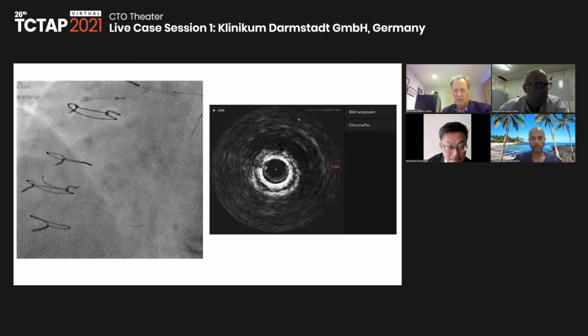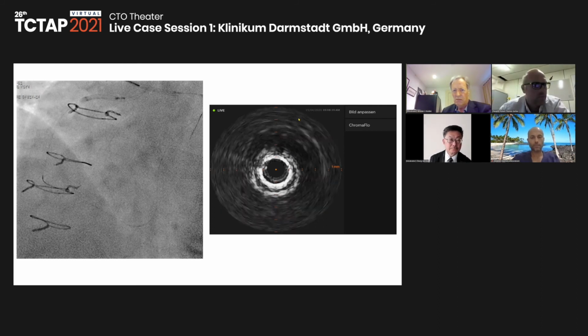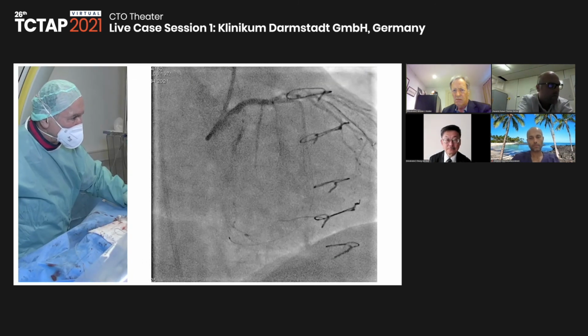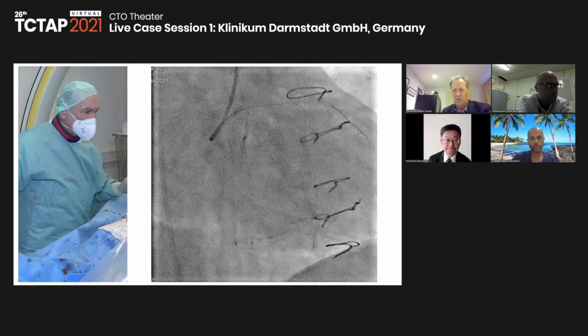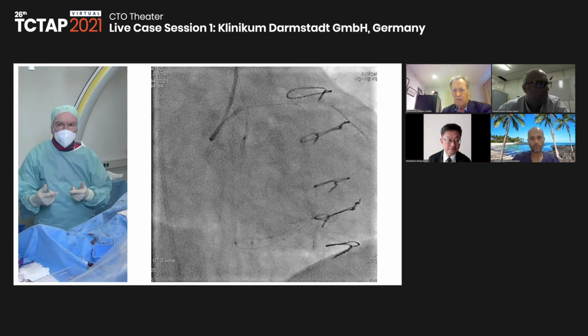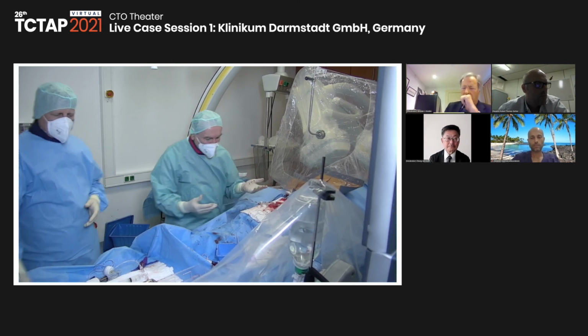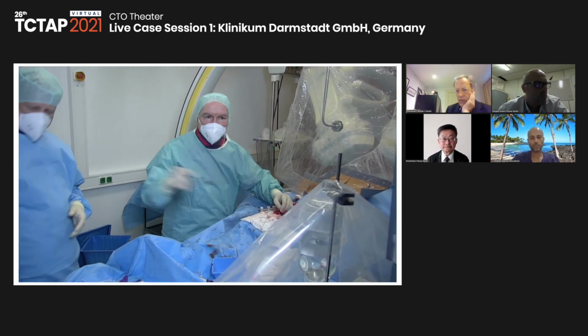The patient has a little bit of complaint, chest pain, so we need to check. The ACT was, I will just inject into the left system, so we are sure everything is okay. Yes, it is. So, of course, sometimes this happens when the collateralization turns over, when you open the vessel and IVUS.